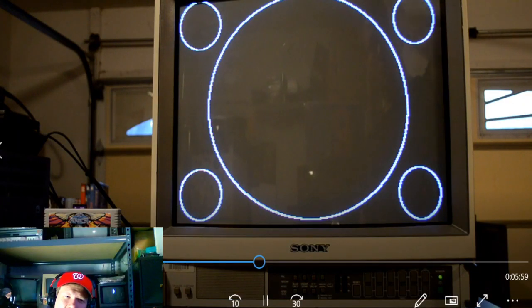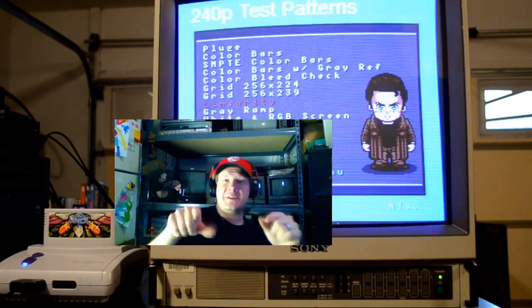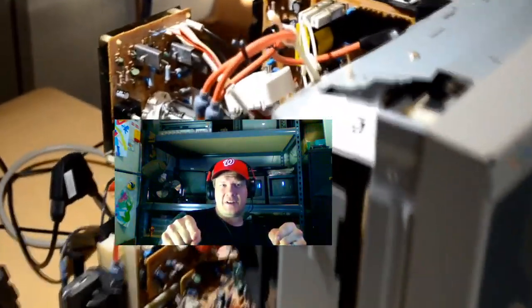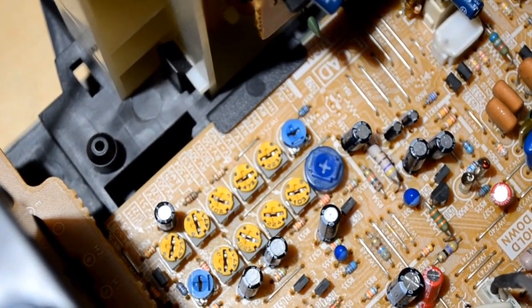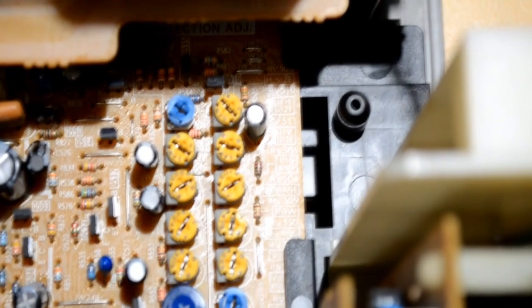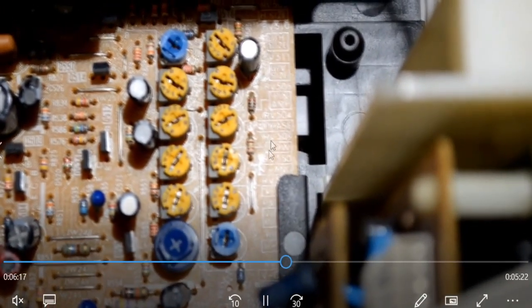Now, I did also make a very big video about the geometry on this specific monitor. It's about 30 minutes, and it shows you how to get into the back of the CRT, which I'm going through right this second, and shows you how to operate these potentiometers, which are in the back again of the monitor. And those are your controls that you have to use to be able to make any kind of screen adjustment for geometry. That includes your underscan settings. They are on there too. So there's a listing right across here of what each one of these settings will actually adjust.